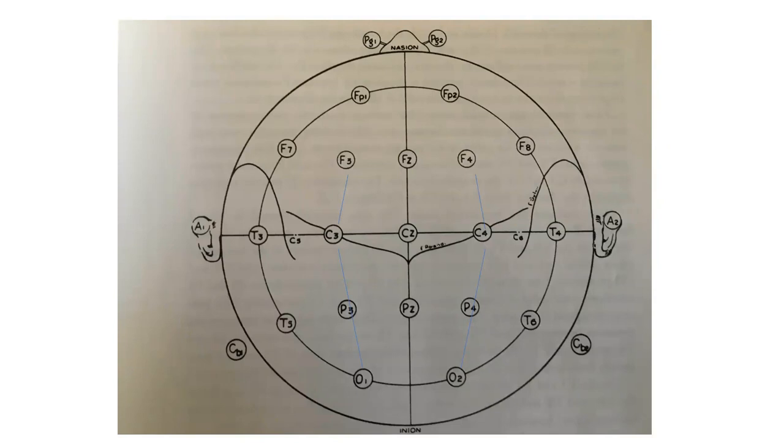So sometimes I look at this when I wear my neurologist hat, and then I look at a different complement of electrodes when I wear my sleep medicine physician hat. So I link my montage a little bit differently when I look at sleep studies than what the American Academy of Sleep Medicine recommends if I'm looking for something different. So I tend to link the left-sided electrodes, so F3, C3, and O1 together rather than linking F3 to the referential one on the opposite side.